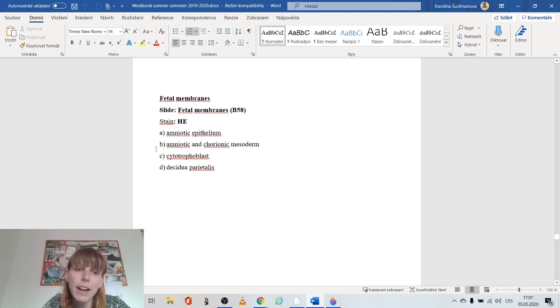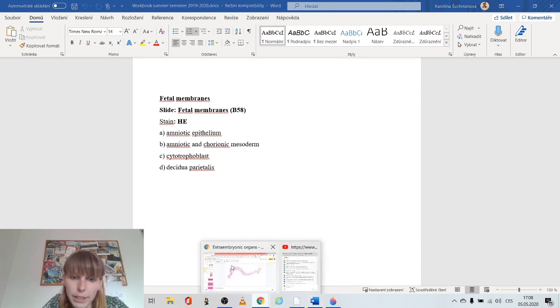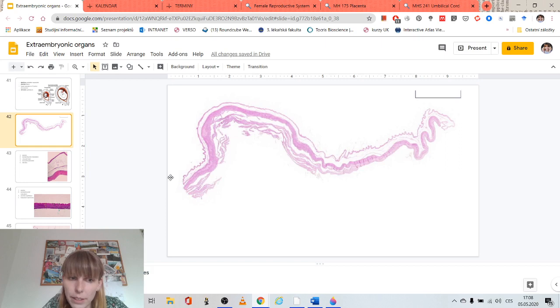And then under this, if you go further down from the amniotic epithelium, you start seeing cells, one next to the other, big ones. So they will be part of the chorion, which is called the cytotrophoblast, and syncytiotrophoblast is just trophoblast, which should be enough. And then in the end, you see decidua, parietalis and capsularis fused together. So that would be this area.